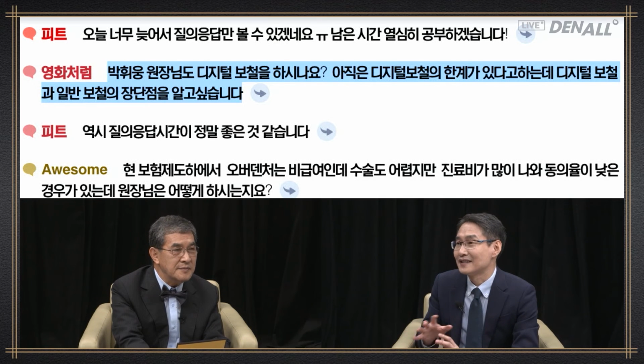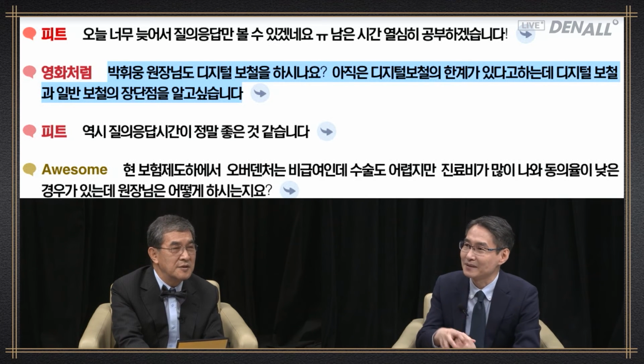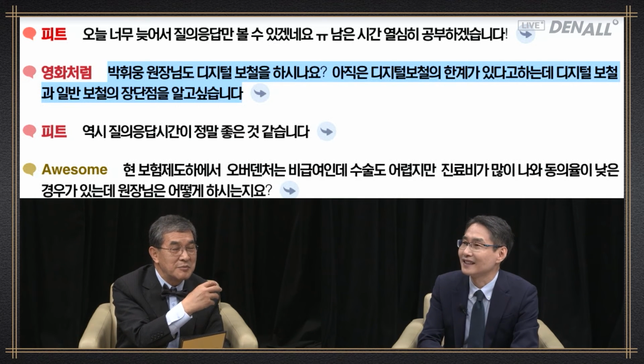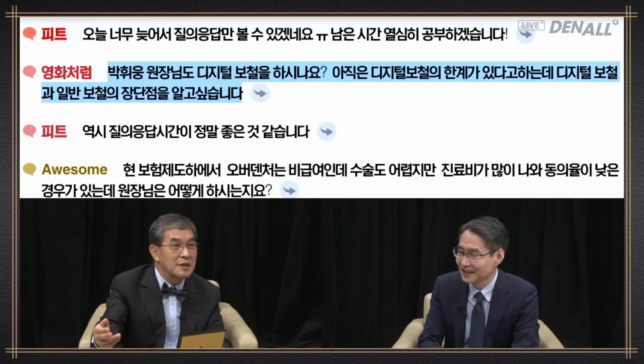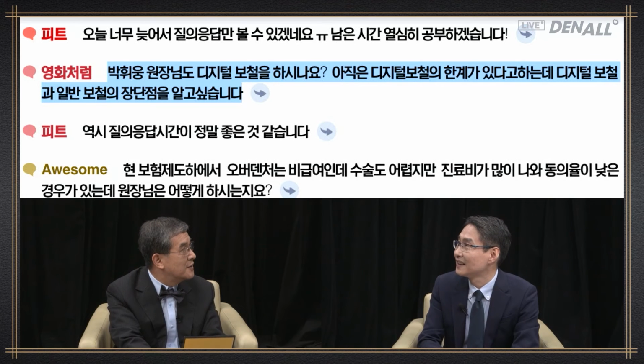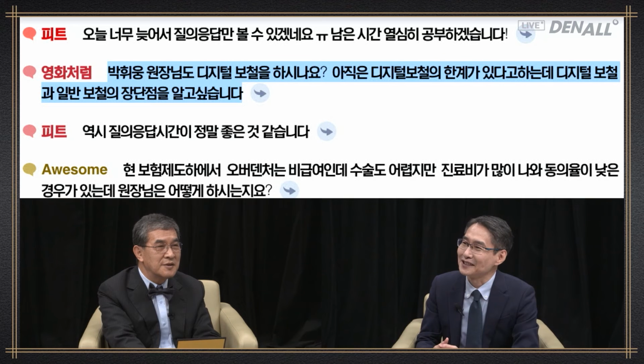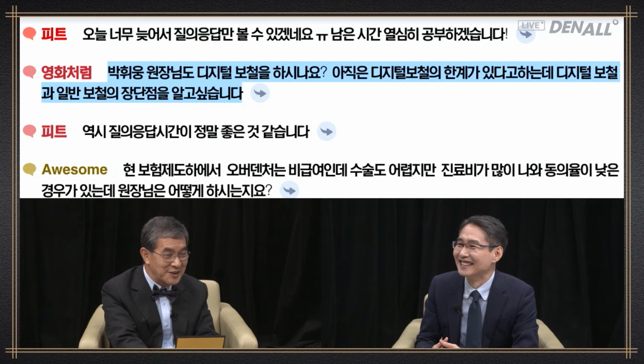For example, you can scan ahead using an intraoral scanner to make the metal part in making a crown for a tooth that has gone through endodontic treatment. For final prosthesis, I use the traditional method. I mill using zirconia. You take an impression using the traditional way. However, the lab uses digital technique to come up with a zirconia restoration. I feel that's right. Without a model, I don't really feel at ease. That's because you're used to it.